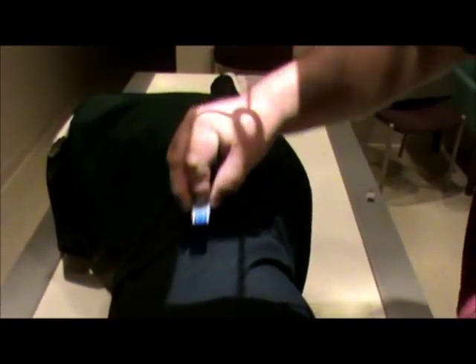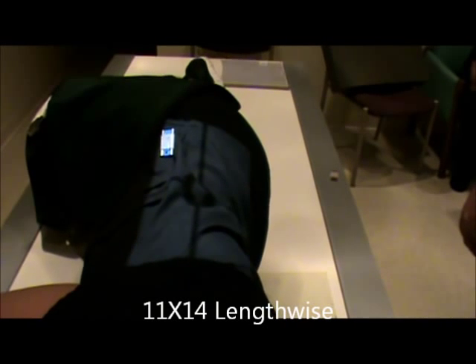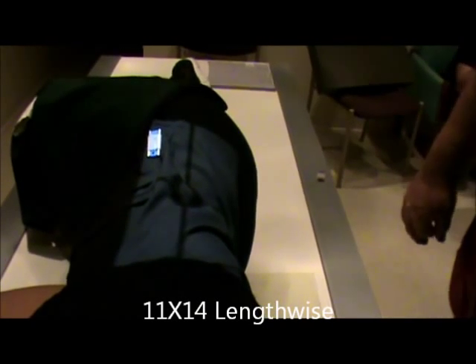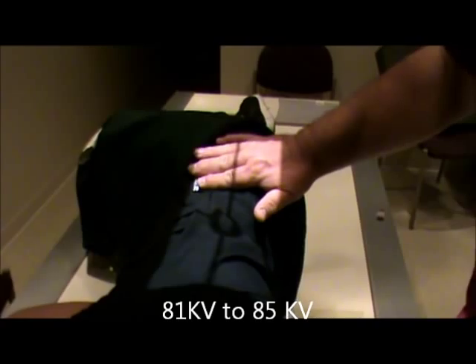That will be our centering for the lumbar lateral. Our collimation is going to be to the IR borders up and down, and we want to make sure that we do have a little bit to the posterior part of the back. Marker placement can go in the front, either corner, higher or lower on the patient. The film size remains the same — 11 by 14. The technical factors will be 81 to 85 kV, center cell, automatic exposure control. The patient is laying on their left side, so we are using the left marker. This is our lateral lumbar.